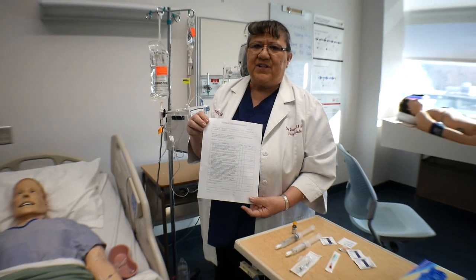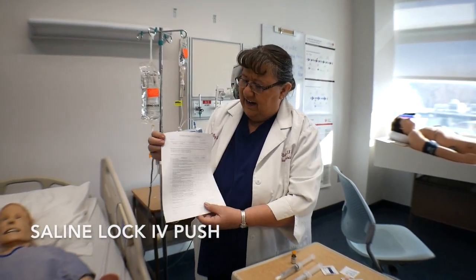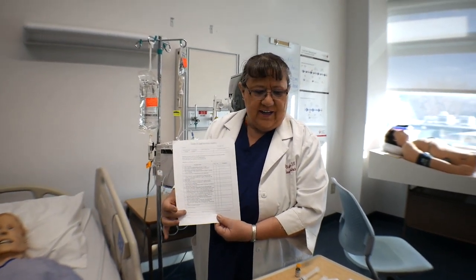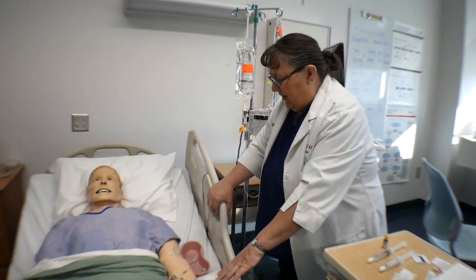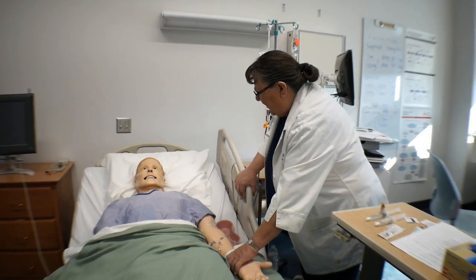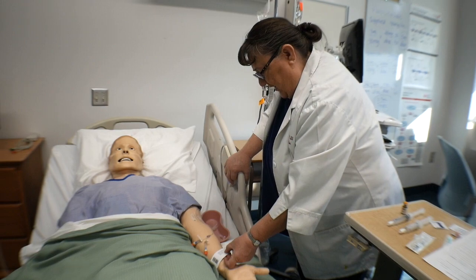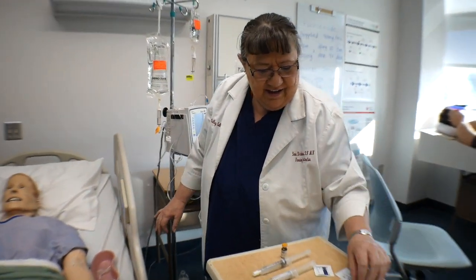Okay, so I'm going to demonstrate giving the furosemide through a saline lock. So I have my checkoff sheet here. It gives me the steps on doing it. So first of all, I'm going to verify my patient. So hi, Mr. Smith. I'm going to be giving you your furosemide. So I want you to identify your name and date of birth for me. And I'll check that against my order.